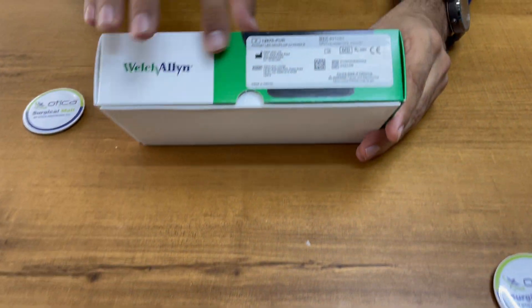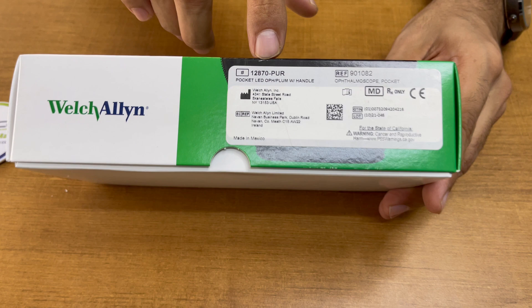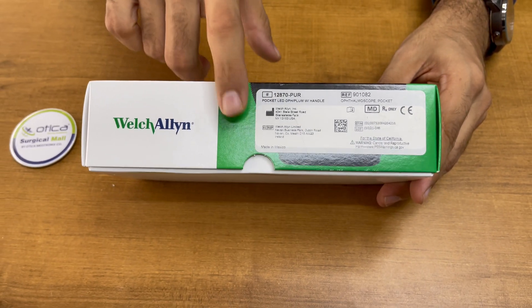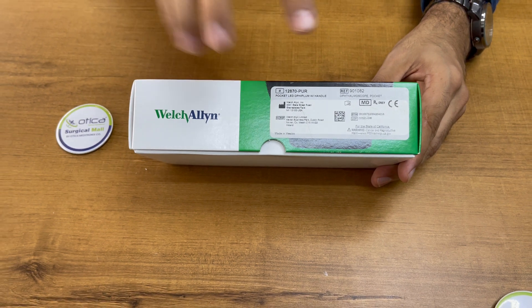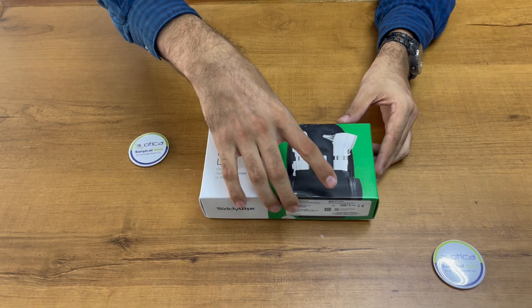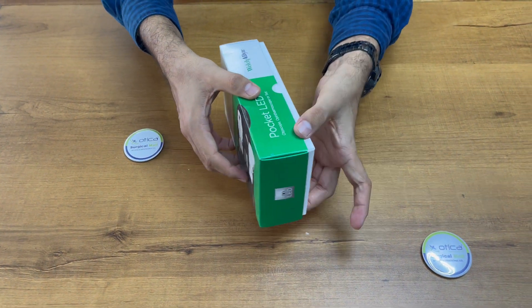We are going to unbox this device. 12870 is the ophthalmoscope series, and 22870 is the otoscope series. The box will remain the same; they don't provide any kind of seal anywhere.